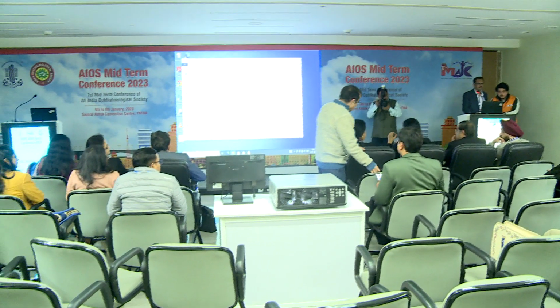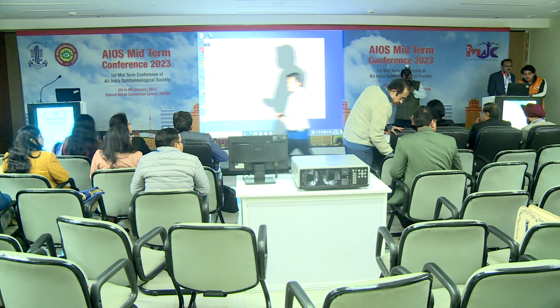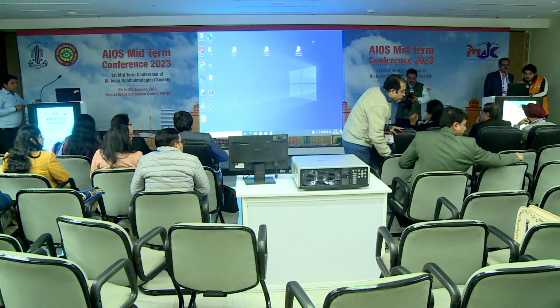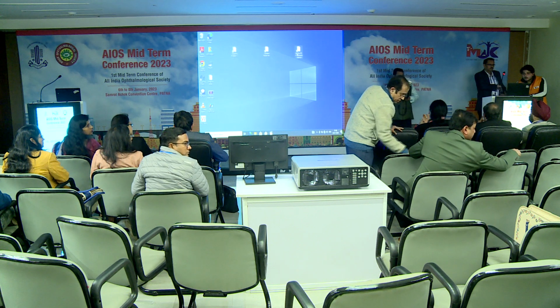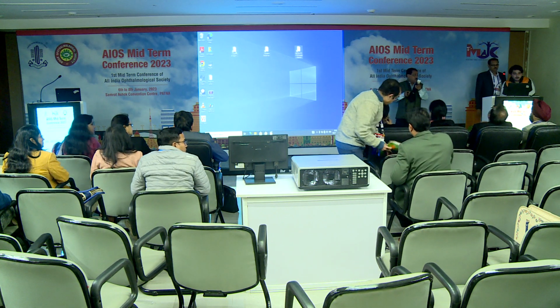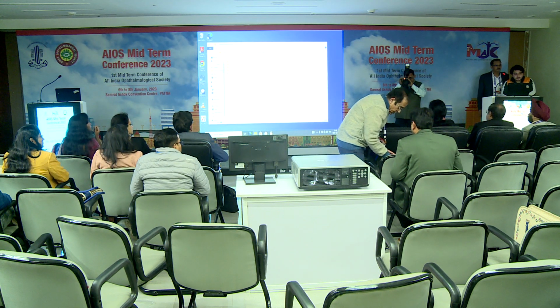And if your patient is having recurrent corneal erosions or pain, then probably you can try to YAG it. But YAG is not completely successful in most of these cases. So if it's a large epithelial ingrowth, definitely lifting would be the best choice. A YAG laser more creates a scar around it. So in a peripheral epithelial ingrowth which looks like it could progress, maybe you could think of doing a YAG, but I think the final answer is debriding.